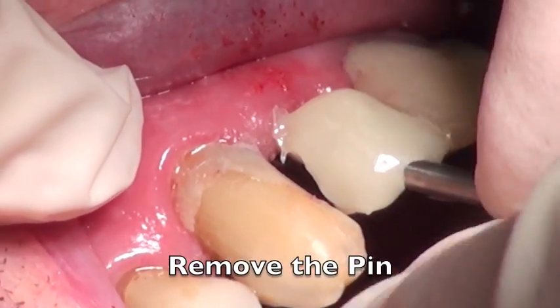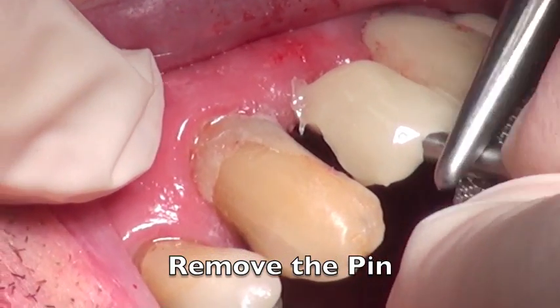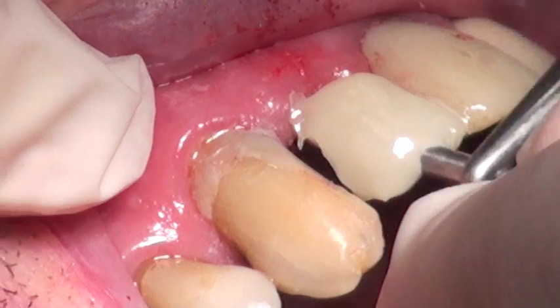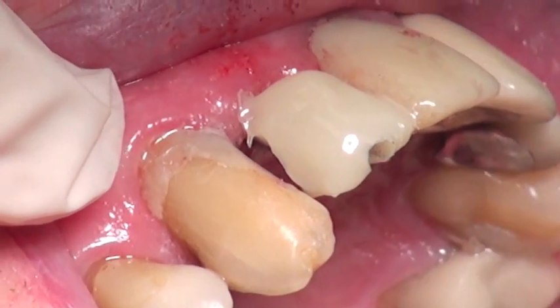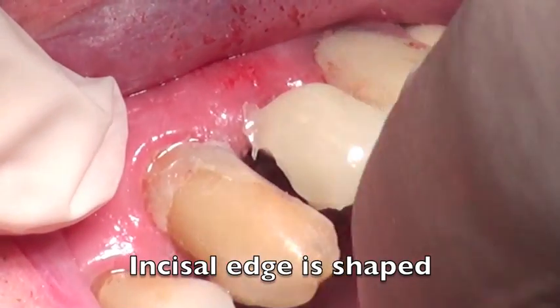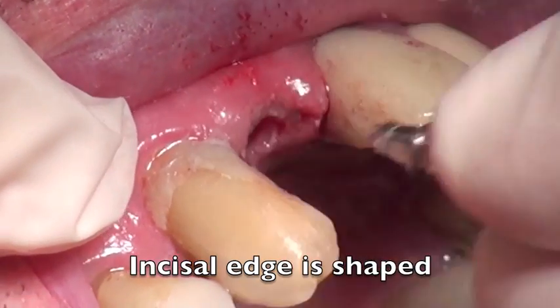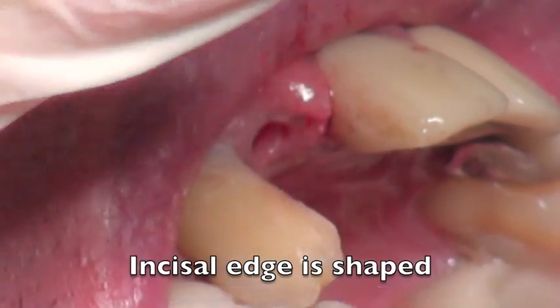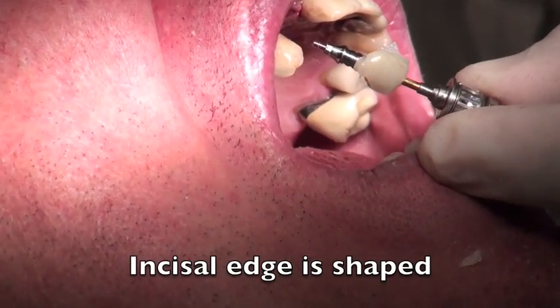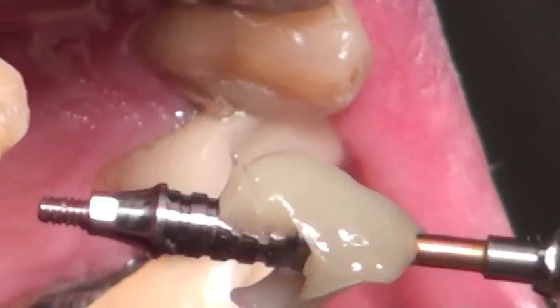Once the resin is set, we're able to take off the plastic stent to get at the actual crown assembly itself. Our goal is to take out this pin, which is just friction-fit inside, so we wiggle it out with a hemostat to get back at that cylinder and at the screw. We take our unigrip driver going inside and just take that screw back out. When we take this out, the whole cylinder and the screw come out with it, because the screw is actually locked inside the cylinder based on the anatomy of the screw-cylinder itself.